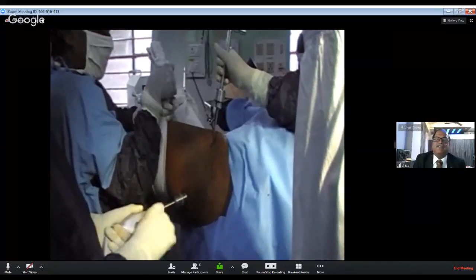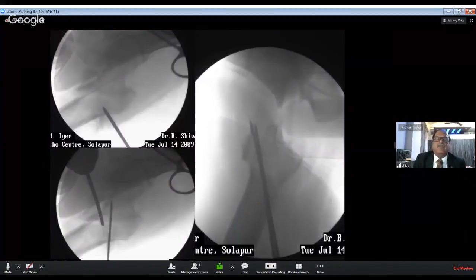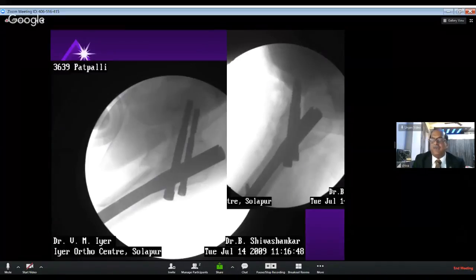Once the fracture was reduced, doing the surgery was a cakewalk. You can see the AP and lateral picture. In the lateral picture, you can see both the K-wires which are being used to fix the fracture, very anteriorly placed. And see the reduction, anterior cortex is very well aligned. The neck shaft angle also looks okay, and there is no retroversion which was happening earlier due to hinging.